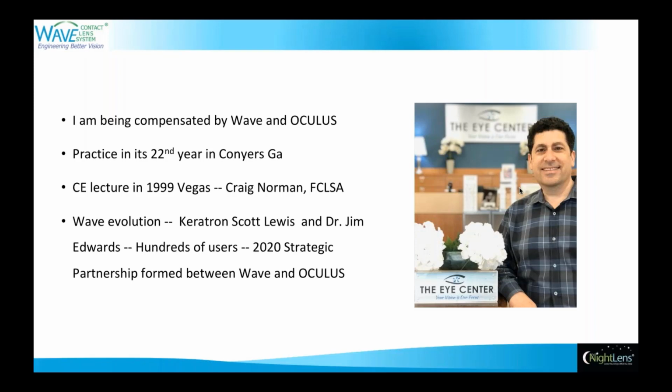So in 2020, a strategic partnership was formed between WAVE and Oculus, and the good news is the team is still intact. Scott is still consulting for WAVE, and you've got Chip and Vance running the operations in Florida. They brought on Sharon Ayers, who's Vice President of Sales and Marketing and very proficient in all things Pentacam. Dr. Jim Edwards is still programming and improving the WAVE software. The only difference is he's got a bunch of Oculus programmers helping him out and bringing forward some really new, exciting changes in the near future, I understand.